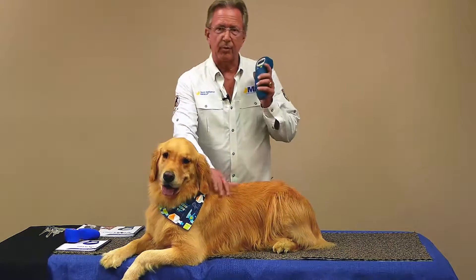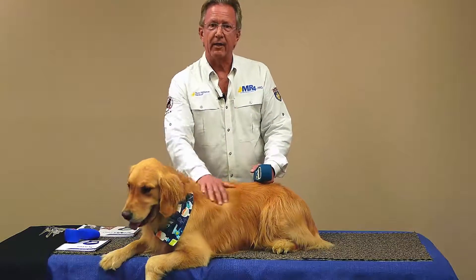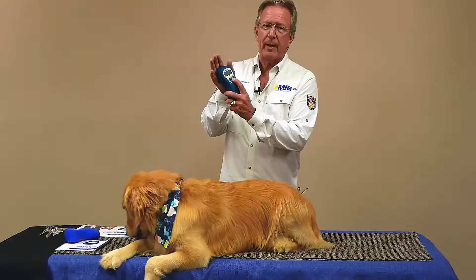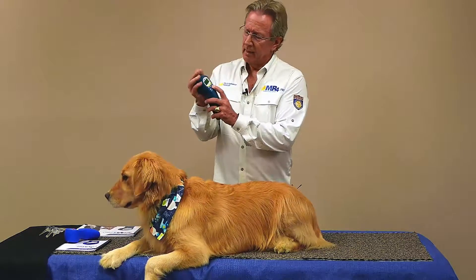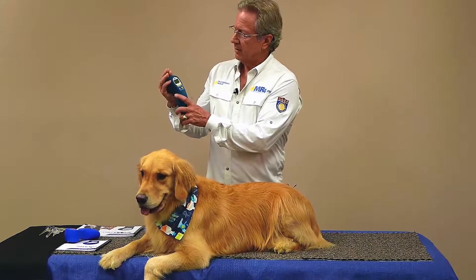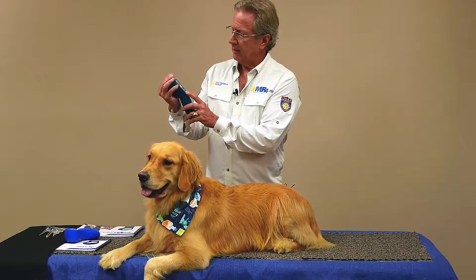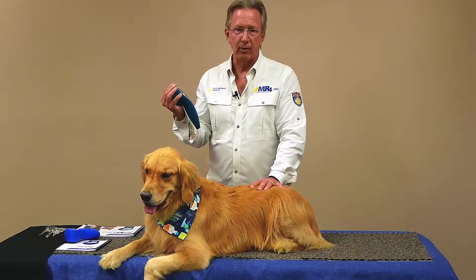The Activet Pro — this is going to be a quick start guide for you as a veterinarian to get started. You just want to have your hand over the front, hold the power button down until it comes on. It will ask you if you want to go through a self-test — we'll say no. It's already set to Activet Pro, we'll select that, and for this purpose we're going to show you the unwind protocol.